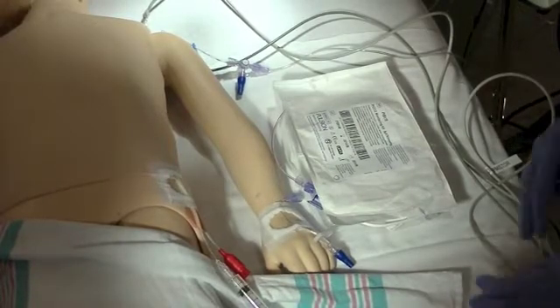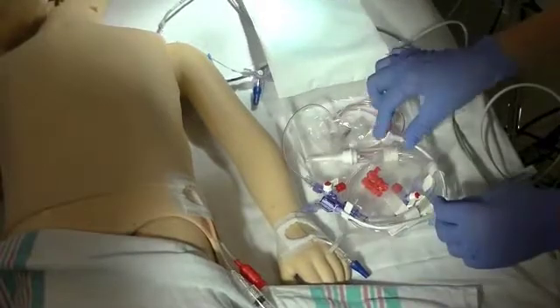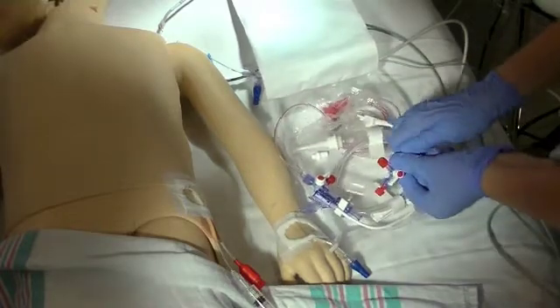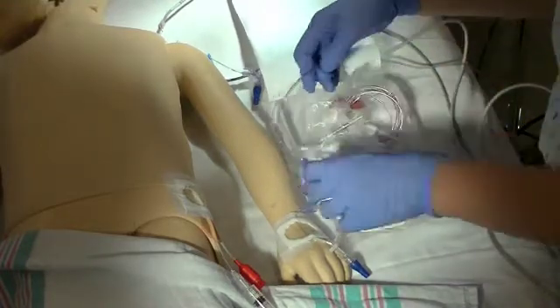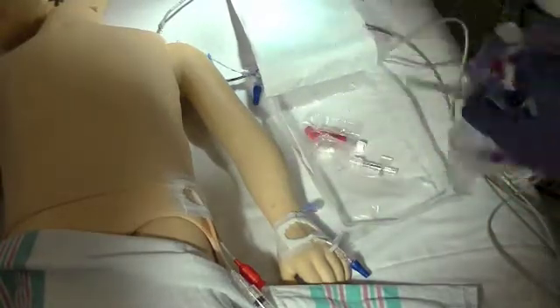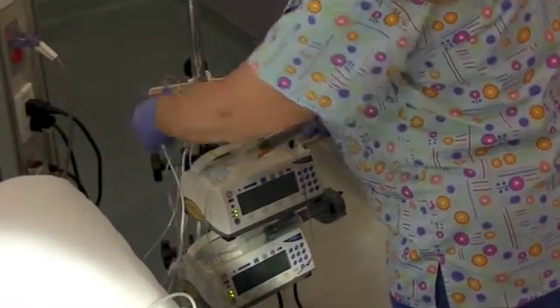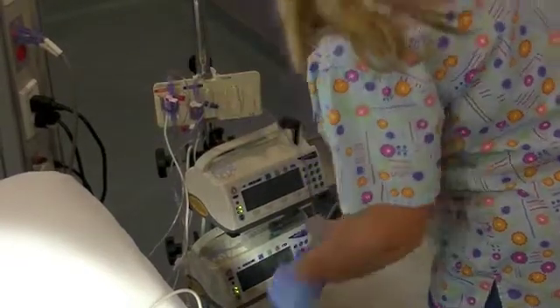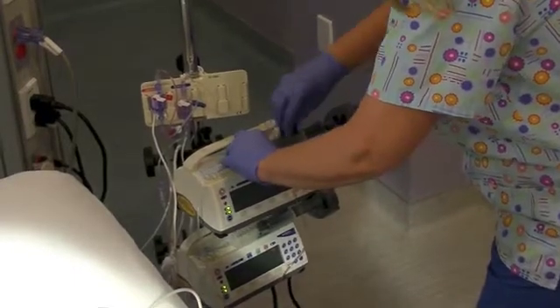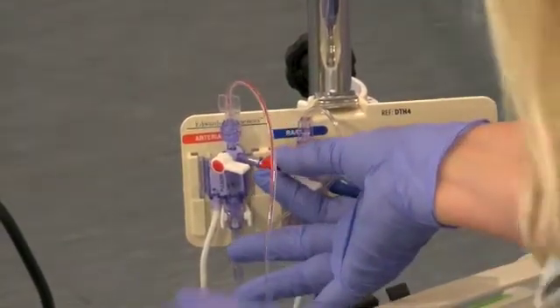Remove the PiCO arterial transducer kit from the sterile package. Make sure all connections are secure. Prime the transducer kit and attach to the heparin bag or syringe according to your facility's policy. Make sure all air bubbles are removed from the system, and finally replace the vented caps on the side port of the stopcocks with the non-vented caps included in the package.